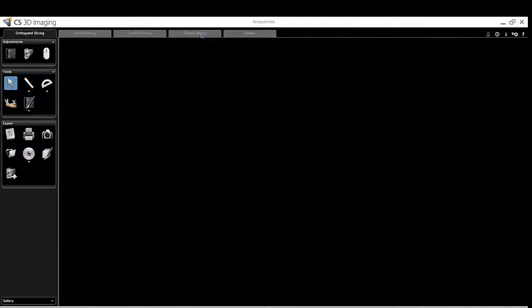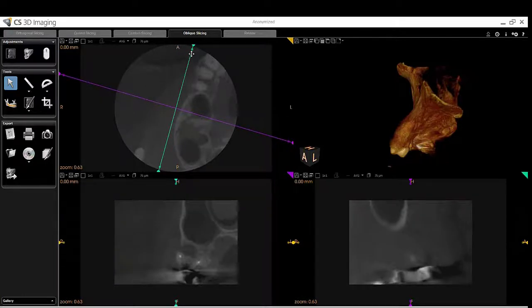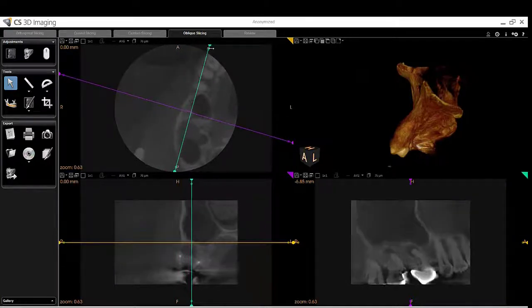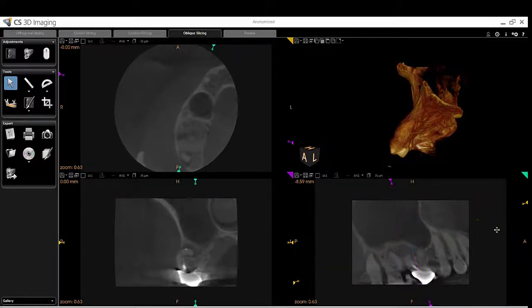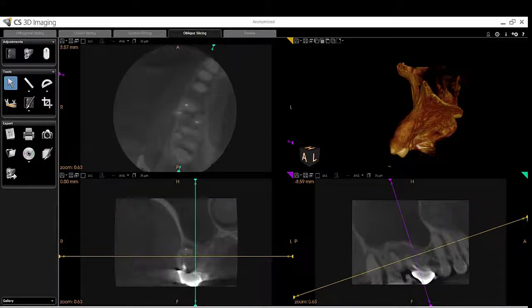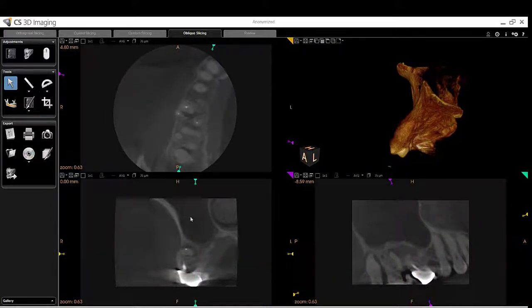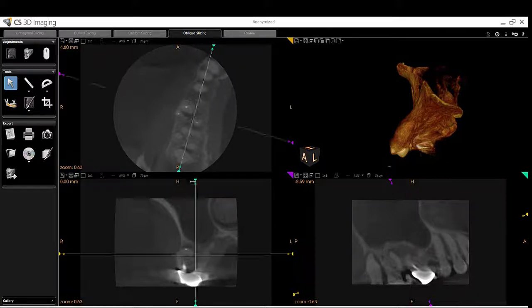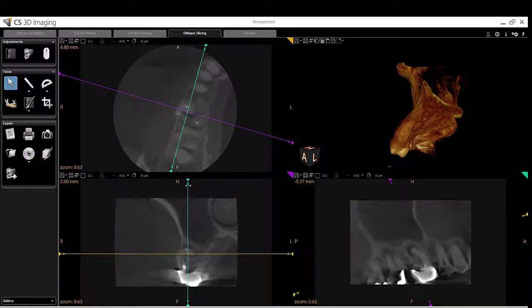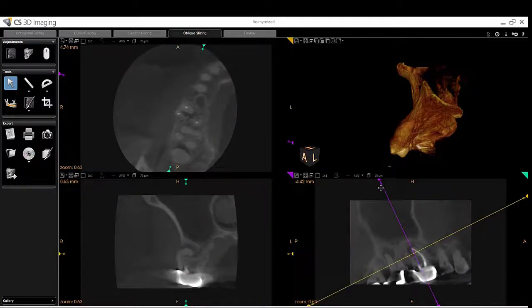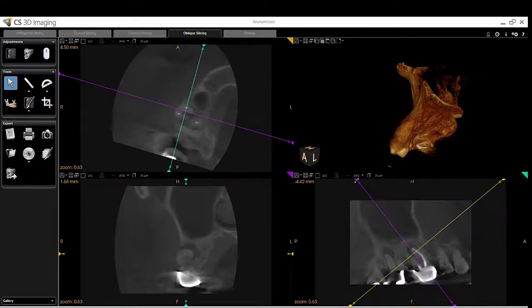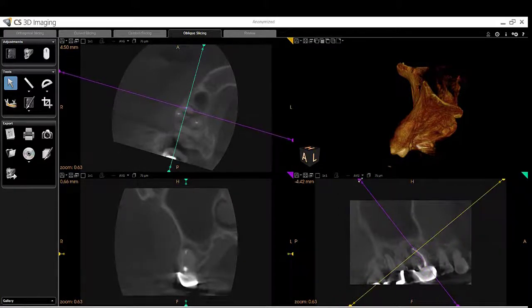I'm going to switch over to the oblique slicing and line myself up with the occlusal plane. For those that aren't really familiar with lining these up, most times I want to line up all my planes with the long axis of the root that I'm looking at or focusing on. For example, this root has a curve here and I would want to look at that root in line as best I could. I can adjust it as I go, but in general that's the approach.